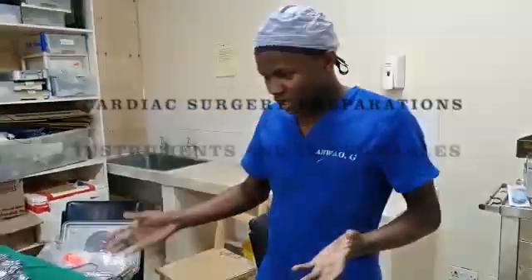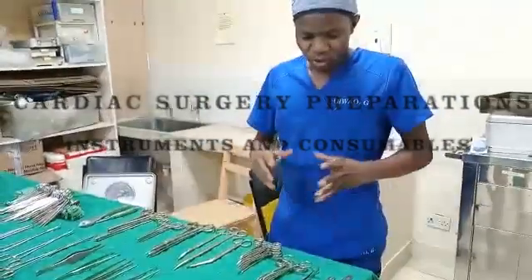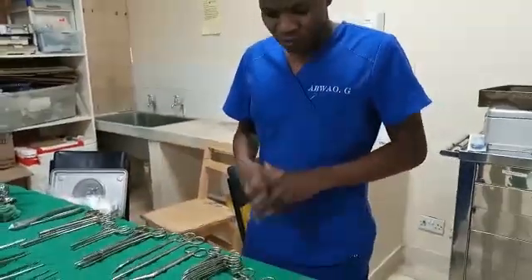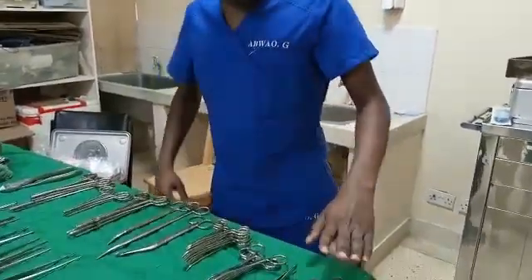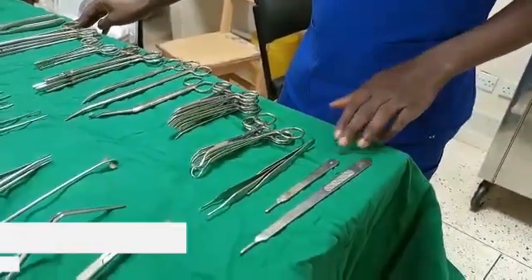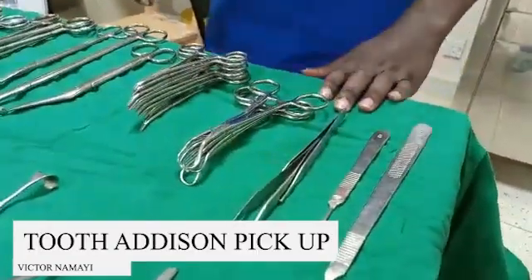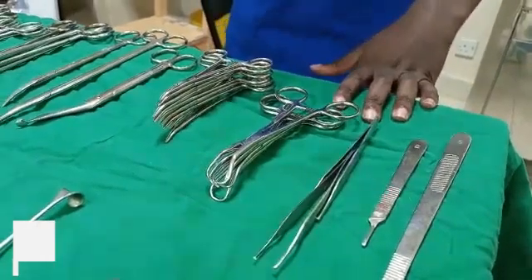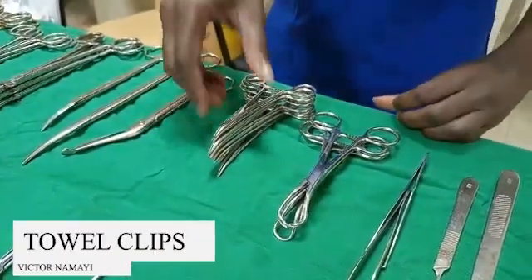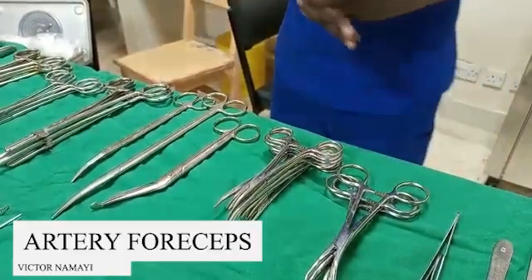With me here there's a simple cardiac set, and I want all of you to see what you need as a preparation for a simple valve replacement. From my left side here, you need a blade holder — a short one and a long one. You need a tooth Addison pickup for retraction of the skin when you make the incision. You need a number of towel clips and you also need artery forceps of different numbers.